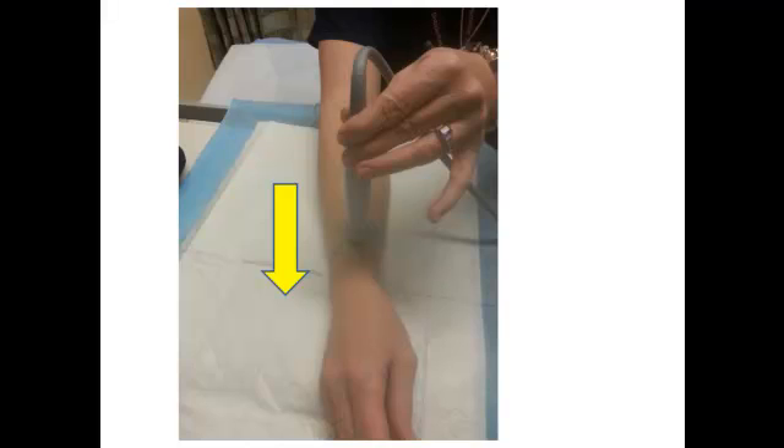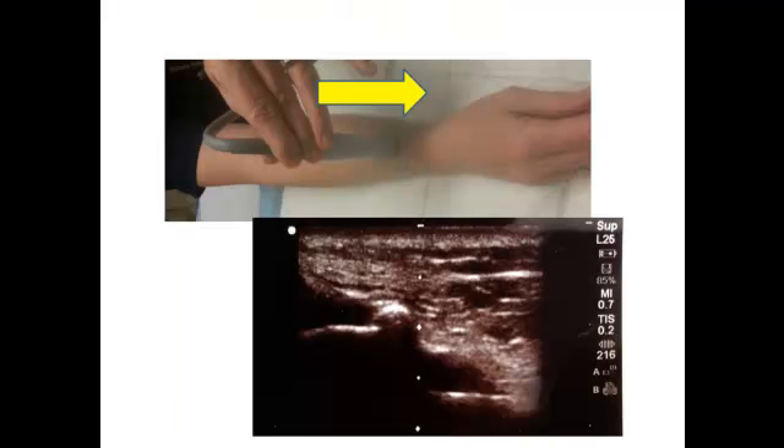Now you're simply going to slide that ultrasound probe distally along the radius until you see the fracture site. The fracture site is going to look like this — a white line that's broken up. I've put two yellow lines indicating where the top part of the radius is broken, and in between that is your break.